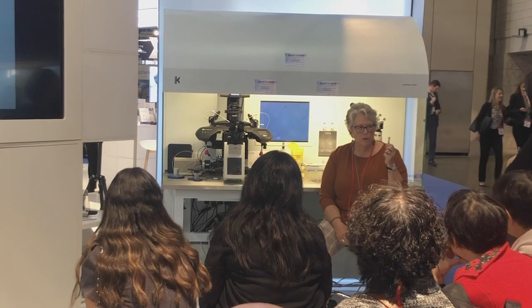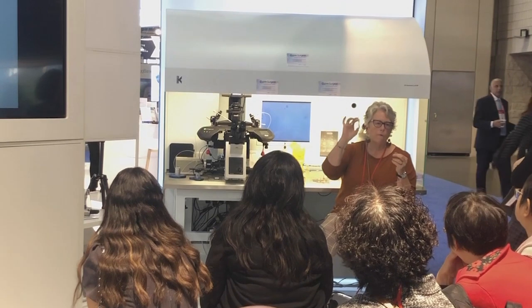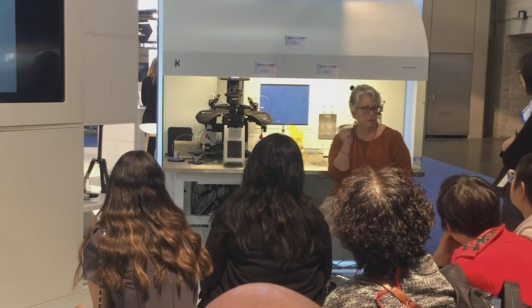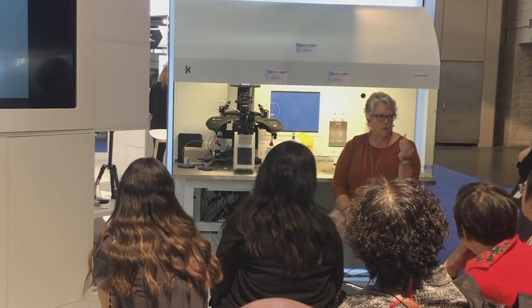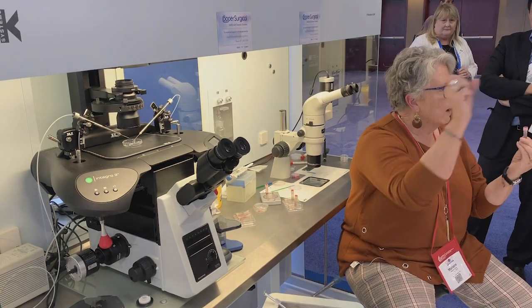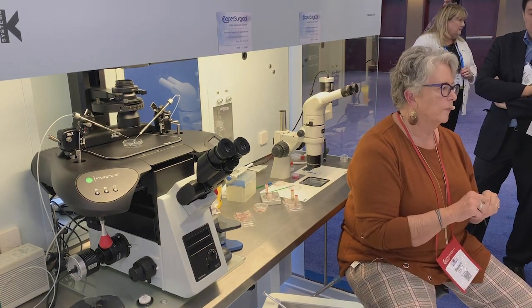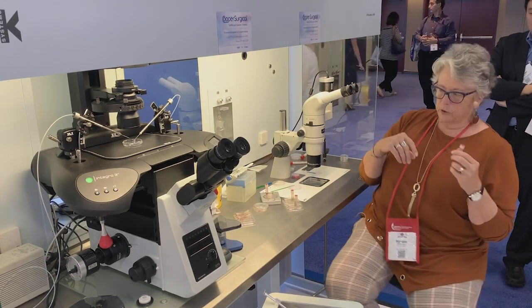The nice thing about these smaller vials rather than the big tubes is that we're going to use this whole vial. So the first thing to do, when you're ready to warm, is don't take the vial out and do this to it. If you want to do this to it, do it before you put it in the incubator, because anything you do to this is going to adjust the temperature. So you want to grab this vial, bring it out, and pour it. Don't pipette it. You don't need to pipette it. You're going to pour it into your first dish, the thaw solution.